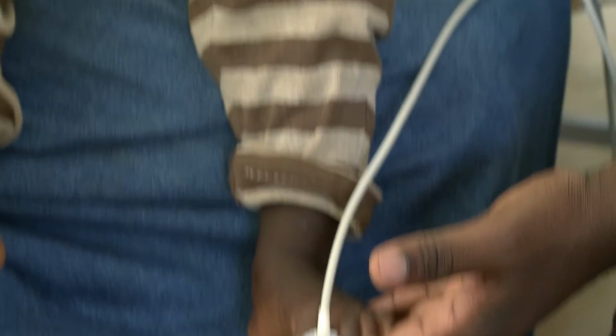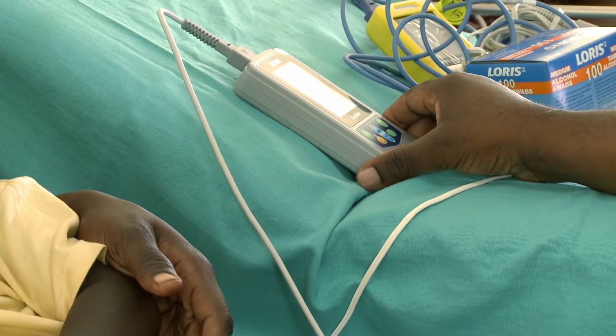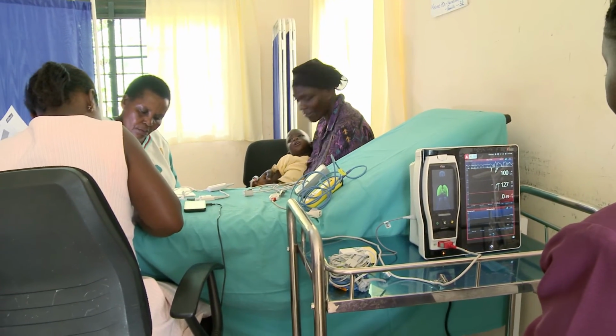And then after the assessor completed their assessments using either two or three devices, depending on the device set, we had an expert counter come in who also used those same devices. So in this stage of the trial, we actually had three reference standards. We had our gold standard, the Masimo Radical 7 machine. In the case of the respiratory rate timers or apps, we had the expert counter. And then we also videotaped some of the respiratory rate assessments.